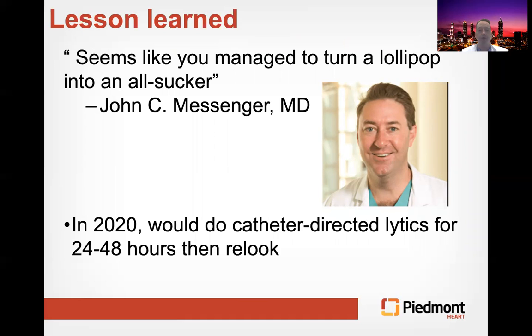In 2020, what I would do is I'd actually go to catheter-directed lysis, I'd give some lytics, and then bring them back 24 to 48 hours and then relook. And that's what I would do today. It would have sped up the case, would have probably resulted in a better outcome, but the patient did pretty well long-term with no issues long-term.